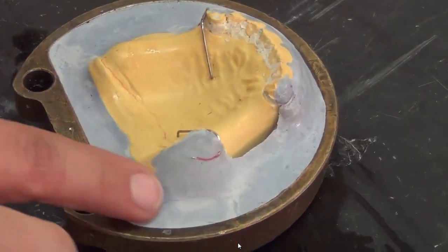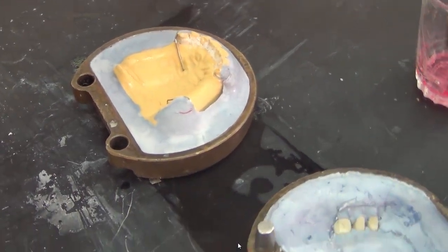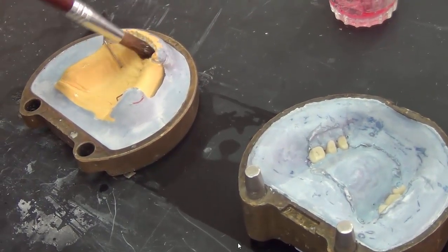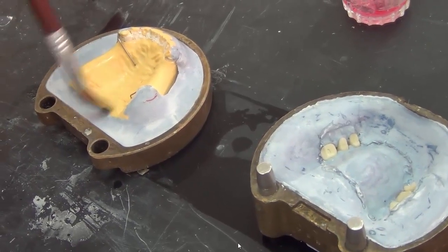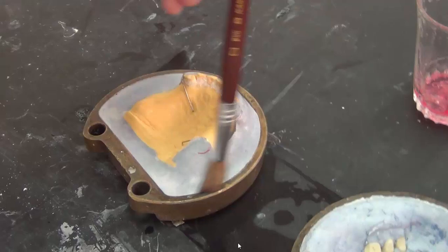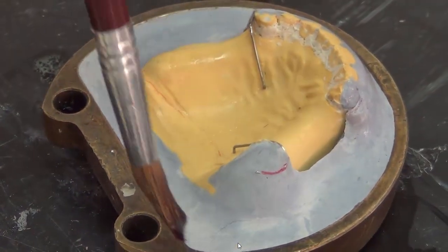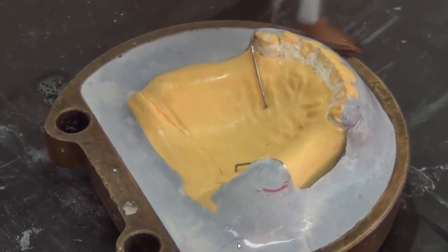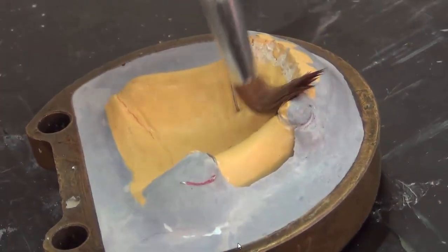And we go back to the first one. We find that because of the warmth of the flask material, it sets solid, and then we paint the second layer. Now in our painting, we make sure it's not visually apparent, so we don't have pools of this material, because pools of this material will cause us to have space between the fitting surface and the acrylic. So we want to make sure that it doesn't pool into place. It's only a thin layer added all around.